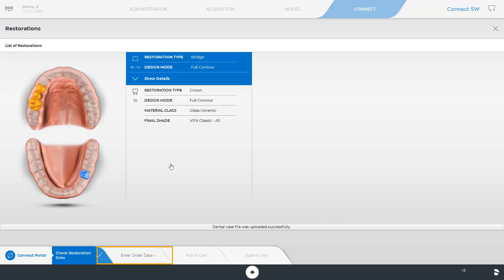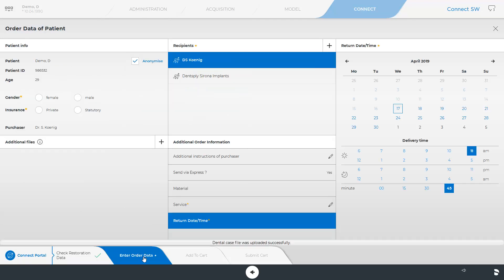As soon as the connection works, we can check our restoration data again and switch to the next obligatory step, Enter Order Data. The order data to be determined may differ from lab partner to lab partner as laboratories can individualize their digital order sheet in their Connect Case Center customer account. The order sheets need to be completed by the dentist before sending the case. Fields marked with an orange asterisk are obligatory fields.